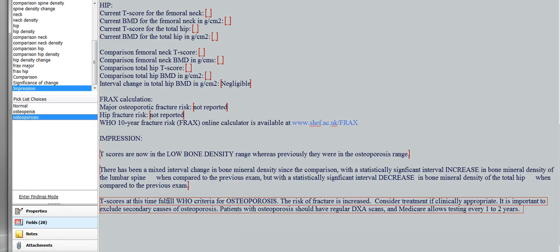Double-click that, and you'll get this same thing, which is similar, but a little stronger. The risk of fracture is increased, consider treatment if clinically appropriate, and then the same thing about the secondary osteoporosis and regular DEXA scans. And that's it.